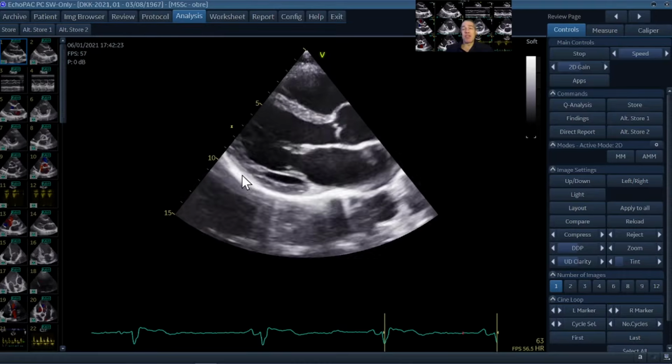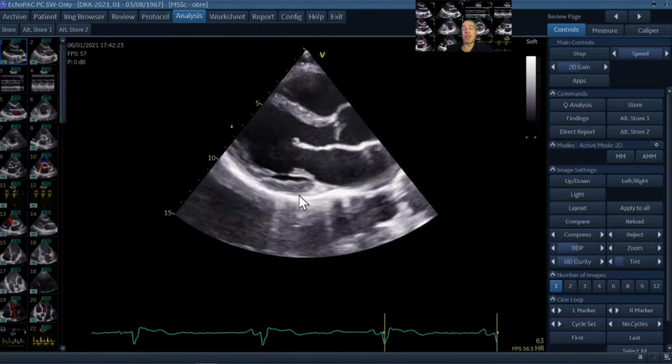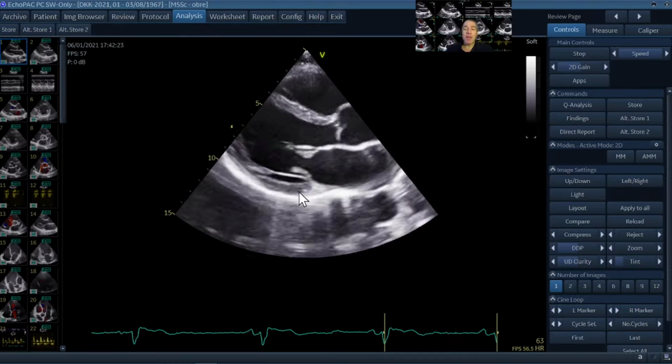Behind that there is a strong ultrasound reflex. This is the pericardium, and you might notice that during systole there appears a small cavity here behind, which is actually part of the pericardium, and there is a very, very little bit of physiologic pericardial fluid here, which again is only visible here in systole.